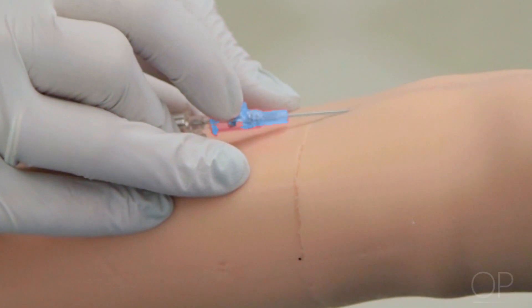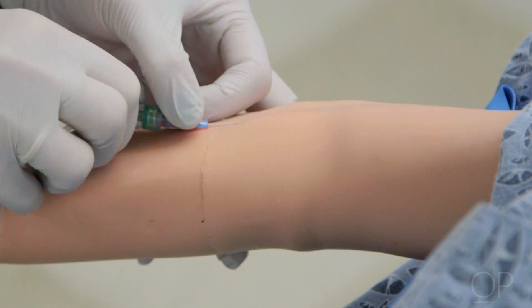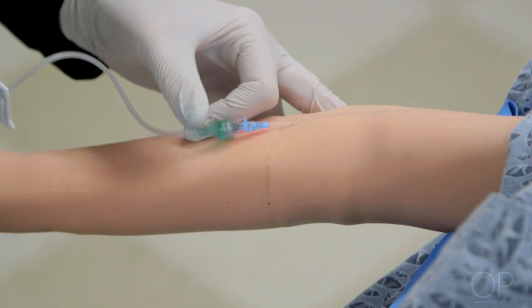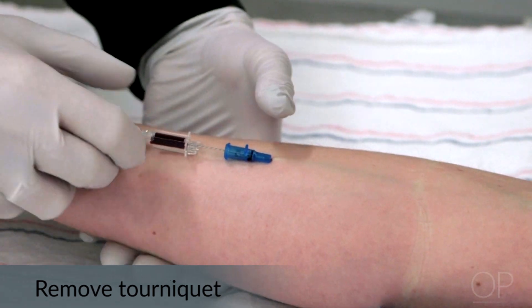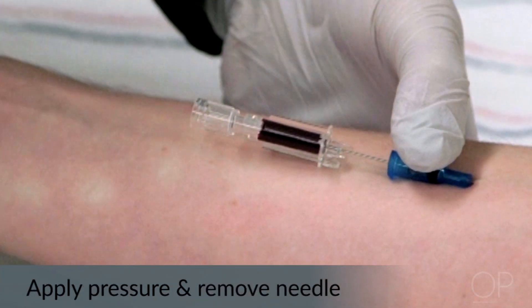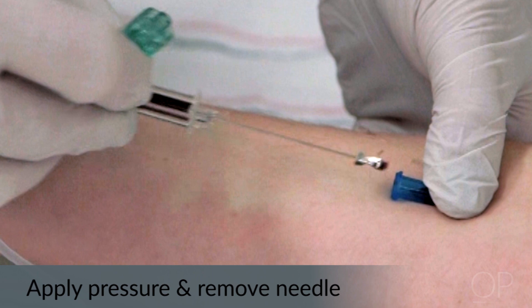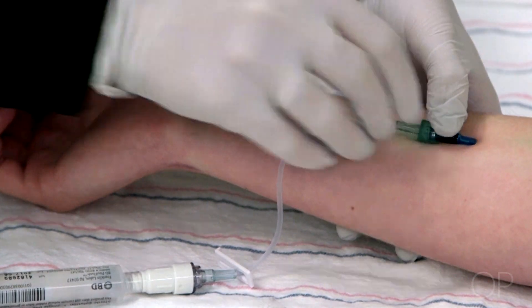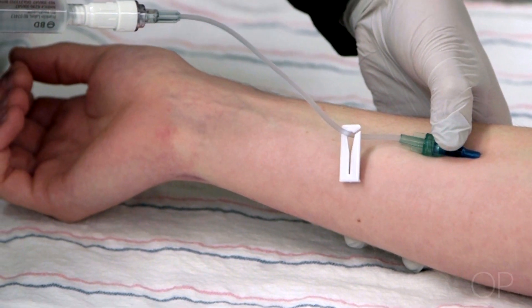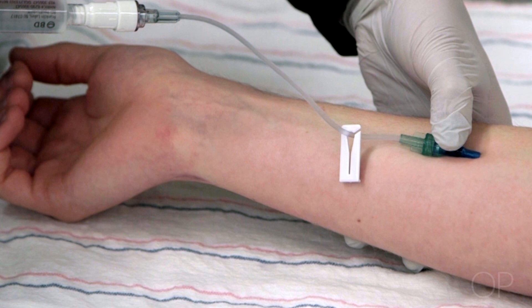Carefully advance the catheter off the introducing needle by simultaneously stabilizing the needle and sliding the catheter completely under the skin. If advancement stops, the catheter may be hitting a valve — you can remove the tourniquet, attach a saline flush directly to the catheter, and try to advance while flushing in saline. After advancing the catheter, remove the tourniquet, apply pressure above the insertion site, and remove the needle. There should still be blood flowing back indicating the catheter is in the vein. Secure your sharps, attach the T-connector, and flush the catheter looking for infiltration, which occurs when the catheter is no longer in the vein and fluid infuses into soft tissue.